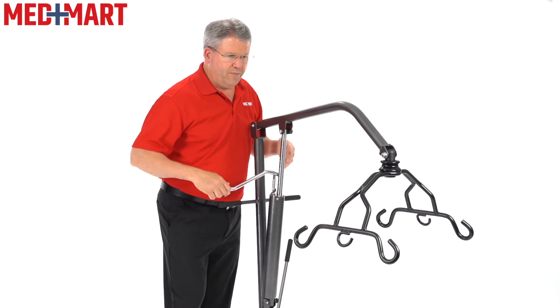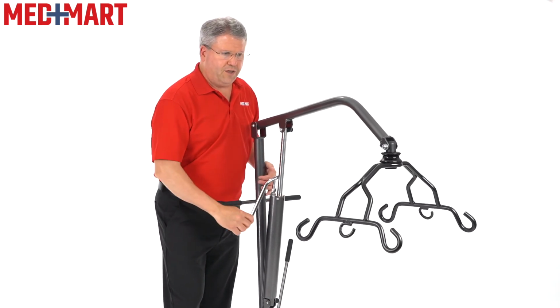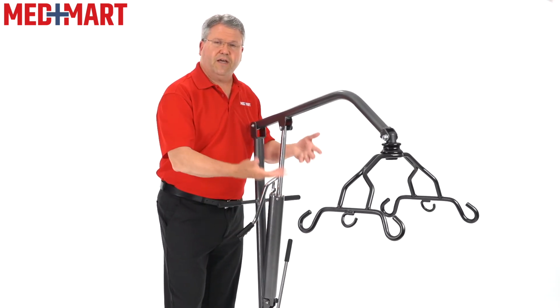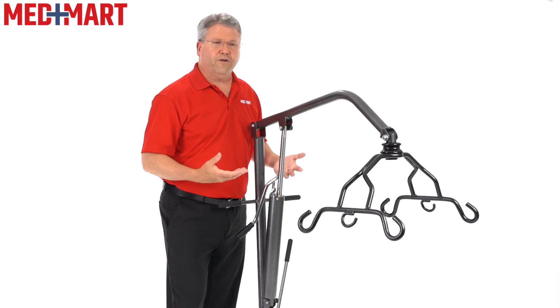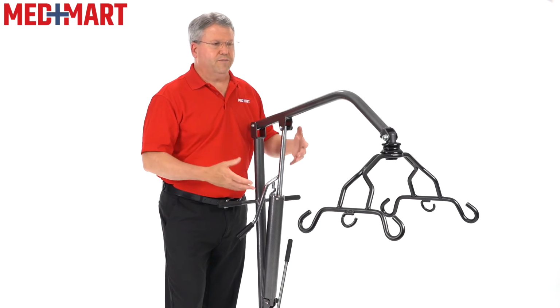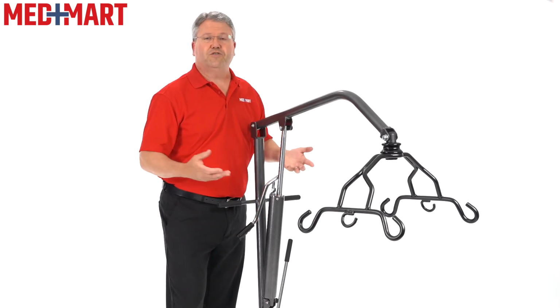So if you do have a lot of movement, as you're moving around from chair to bed, for example, keep in mind you do have to possibly crank this a couple times to kind of adjust the patient a little. But this is kind of the original design of the Hoyer lift. The Ted Hoyer patient lift was originally designed just like this with a hydraulic pump, and this is the design that's been tried and true for many years.